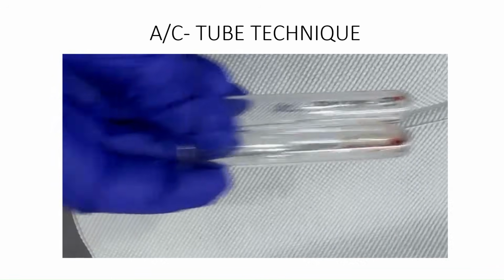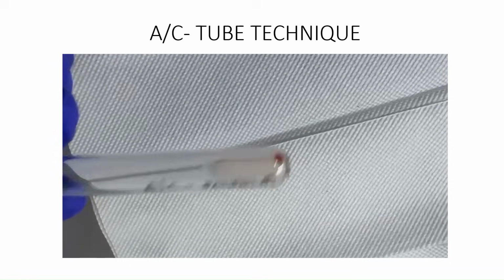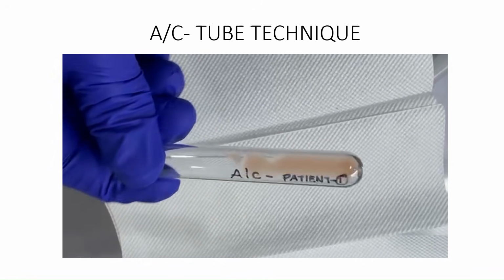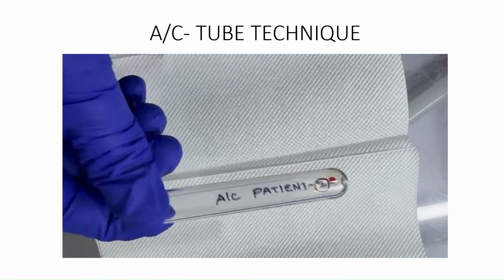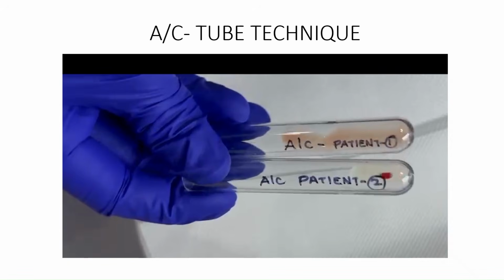Now after centrifugation, take out the test tube and gently shake the test tube to look for agglutination reaction. For patient 1, we can see there is no agglutination, and for patient 2, there is 4 plus agglutination reaction. Hence for patient 1, the autocontrol is negative, and for patient 2, the autocontrol is 4 plus positive.